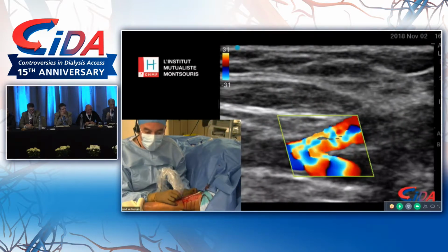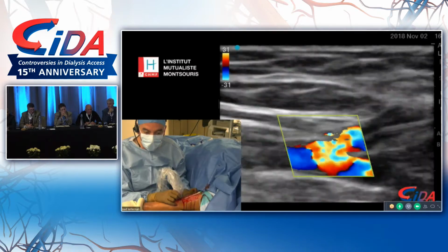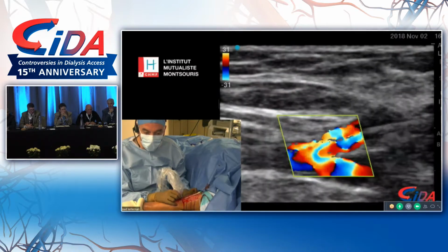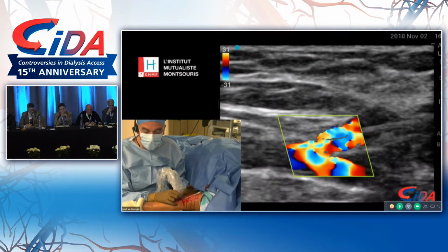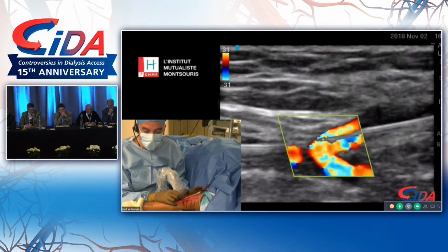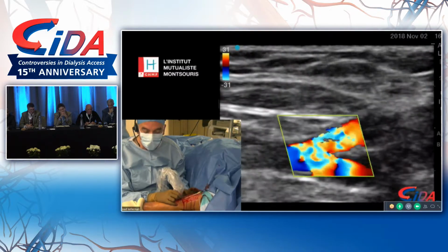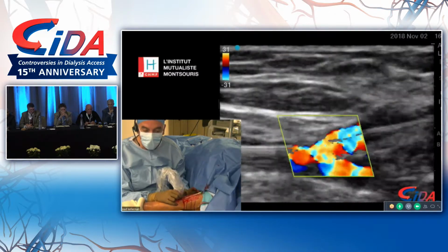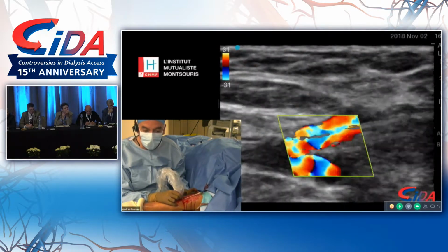contrary to most vascular surgery procedures, where calcified arteries are a big enemy, we didn't have a problem with calcified arteries here, because we have heated pressure that applies on the artery, and this is applicable without any contraindication in calcified arteries. And actually after we balloon them, they kind of stay open instead of having recoil.